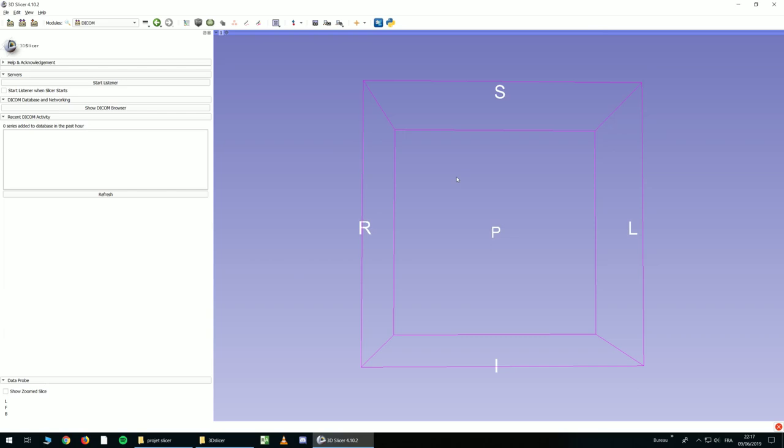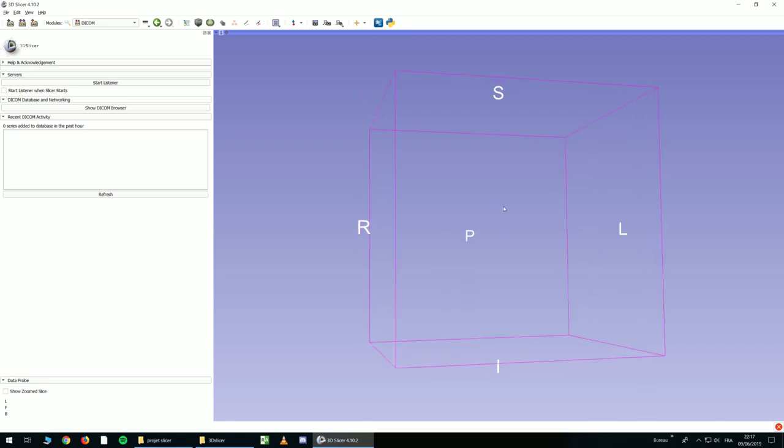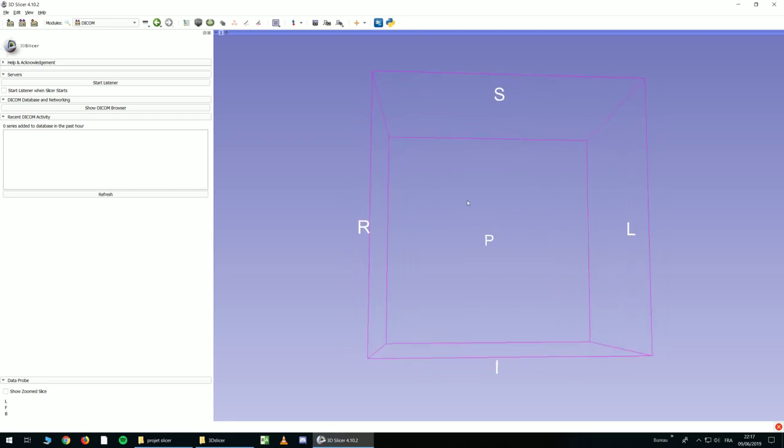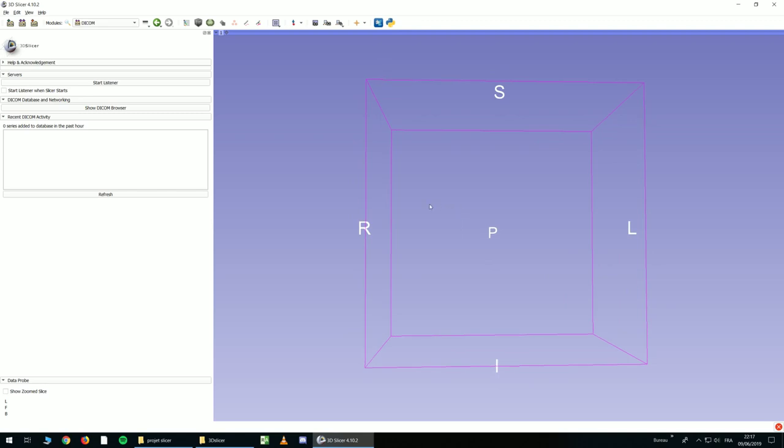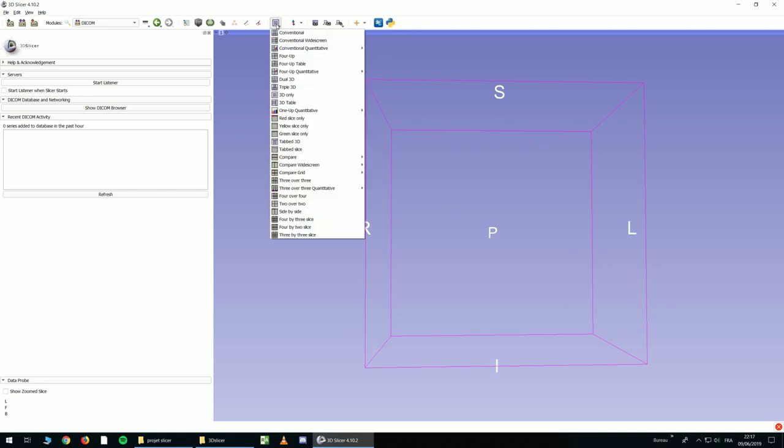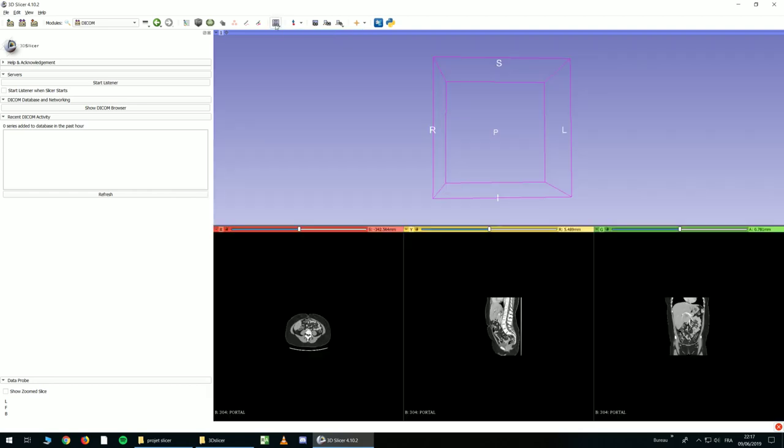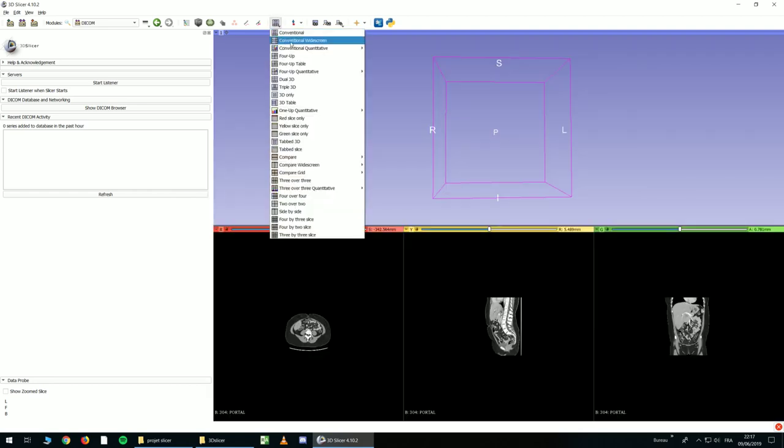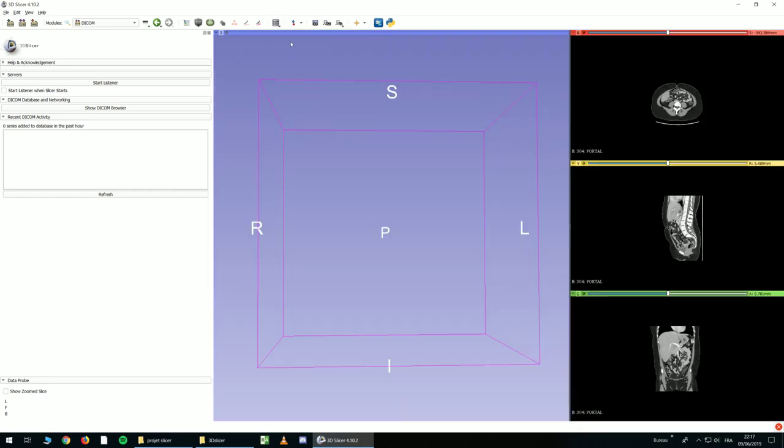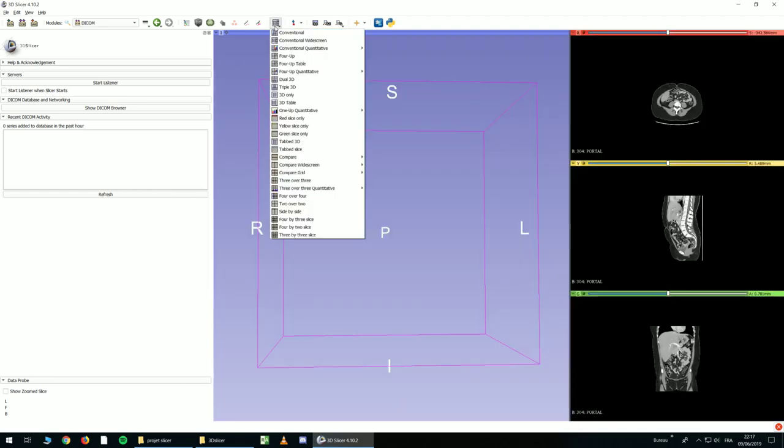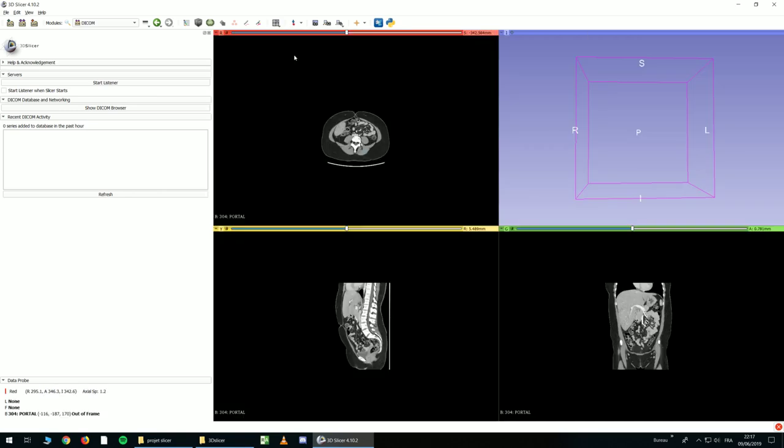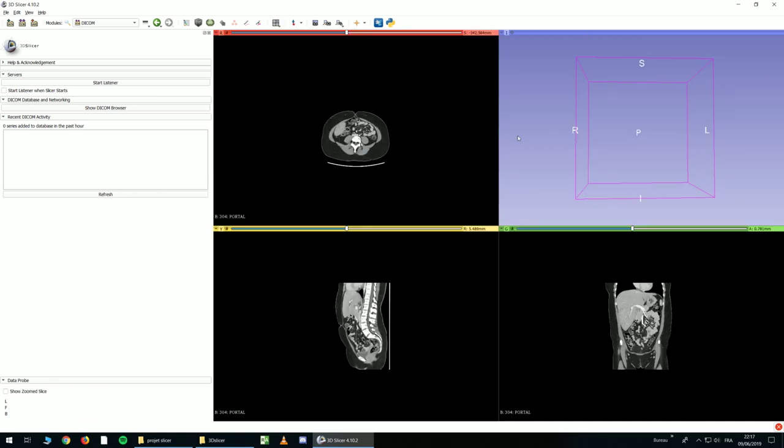And now you cannot see anything, and that's perfectly fine, because you have to choose the view you want to use. So you have to click here and choose Conventional, or Whitescreen, or maybe Foroptable. It depends on the size of the screen and what you want to do. You can choose everything you want.